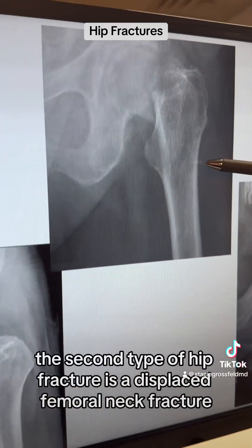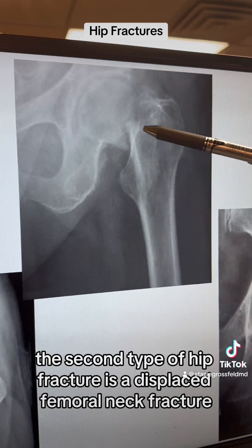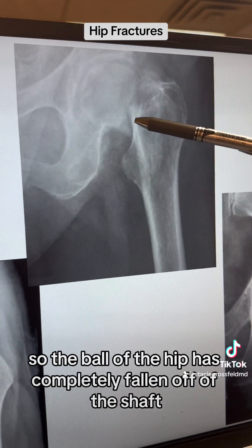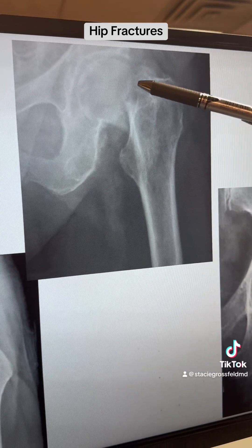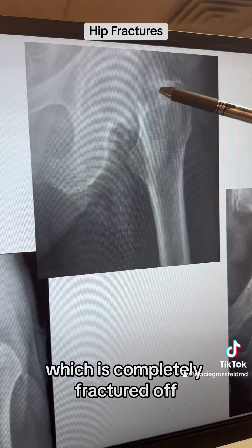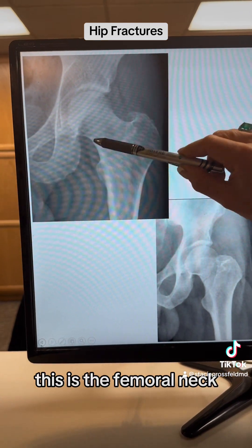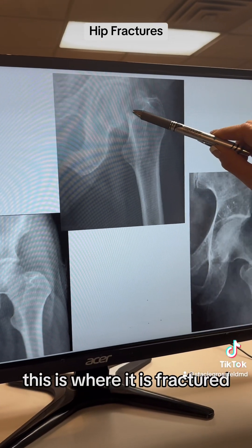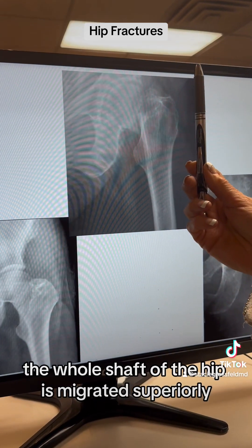The second type of hip fracture is a displaced femoral neck fracture. The ball of the hip has completely fallen off of the shaft. This is the femoral neck area, and this is the ball or the head of the femur, which is completely fractured off. If you look back at the normal side, you can see the femoral neck is normal. Over here, this is where it is fractured, and the whole shaft of the hip has migrated superiorly.